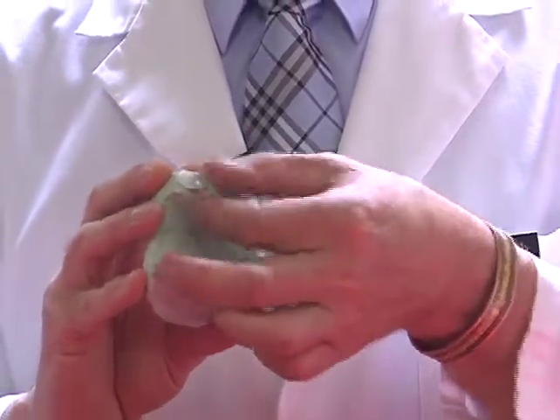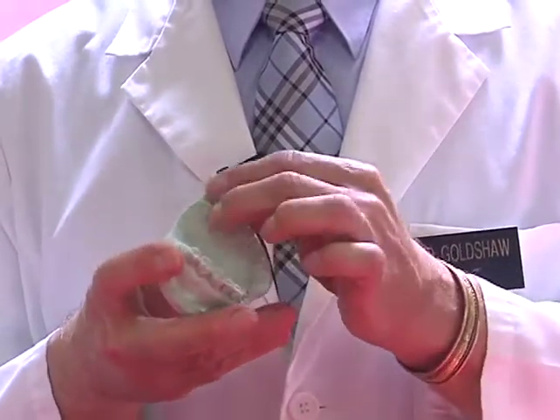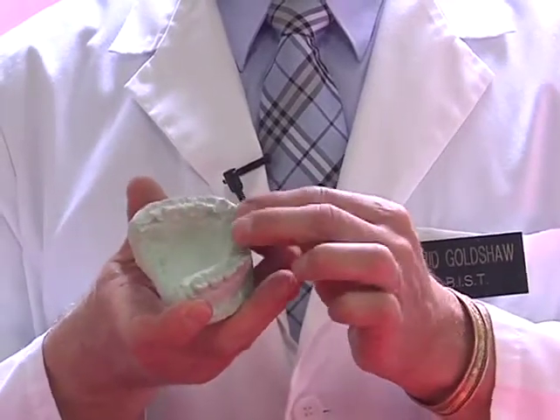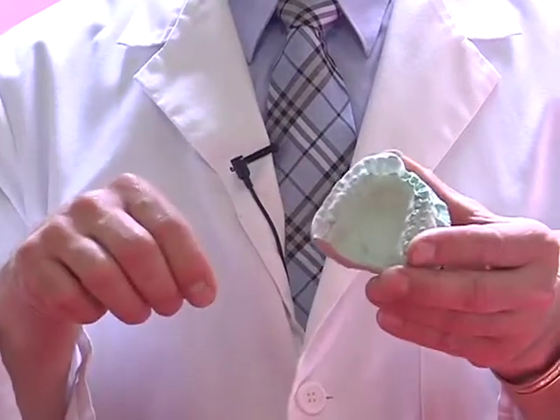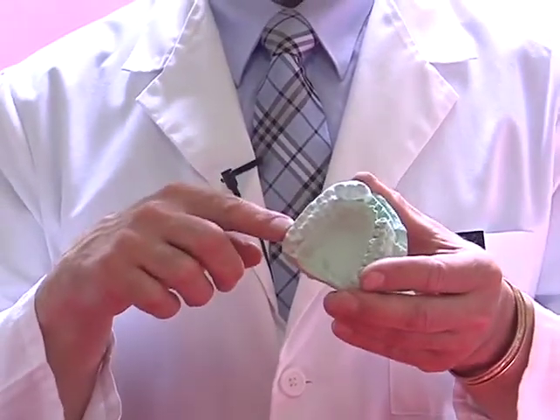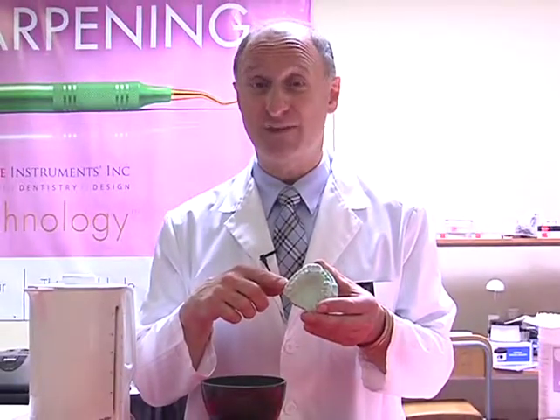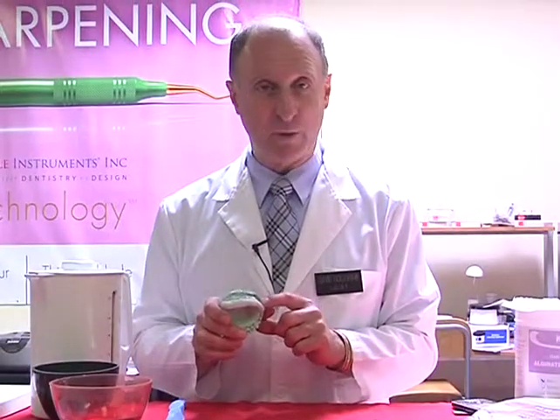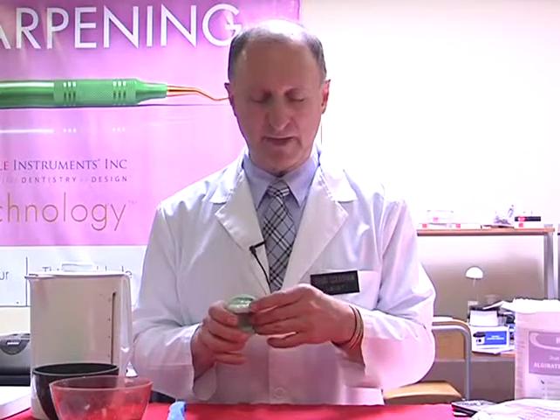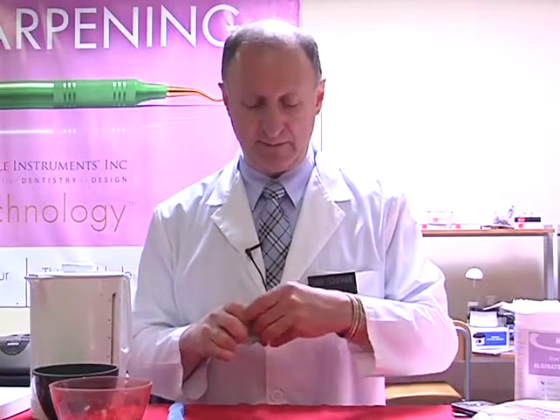It's very comfortable. So I'm just pushing it down lightly, interproximally into small spaces, and then with a light finger pressure over. I then take my air-water syringe and lightly blow over the surface of the material until it turns white again. So it's normally about another 15 seconds. Total time here is 30 seconds inside the mouth. It's very quick. Once the material has turned white, it's sufficiently cooled, and we can remove it from the patient's mouth. With a light pressure, you'll notice that it fits a lot tighter than a bleaching tray inside the mouth.